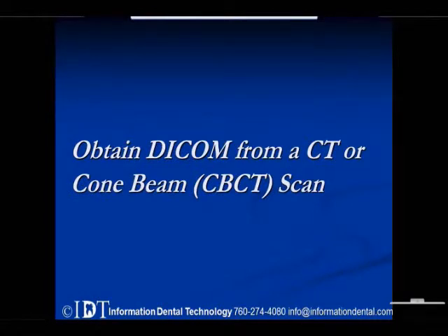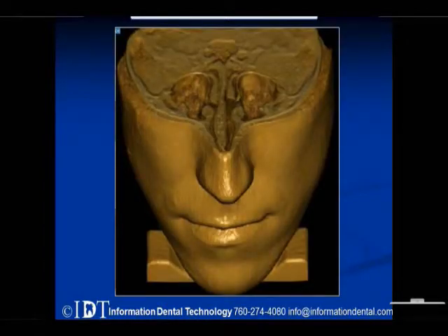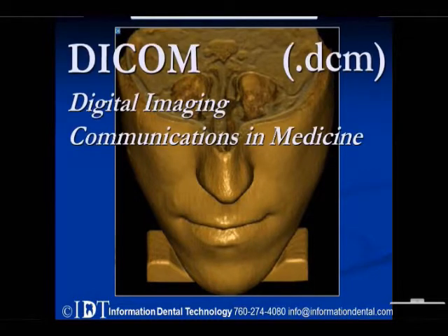So the first step to this whole process is to obtain a Dicom from a CT or a cone scan. A lot of people get confused as far as what's Dicom and volume and the different types of CT scans. So we're going to go over exactly what Dicom is when you're requesting that from your scan or from your technician. So Dicom stands for Digital Imaging Communications in Medicine. And what that means is it's just how we communicate digitally with medical images.